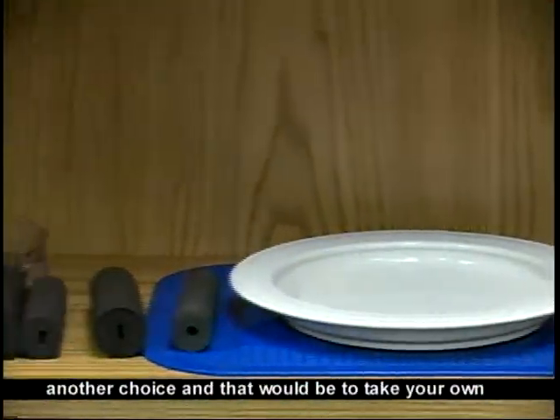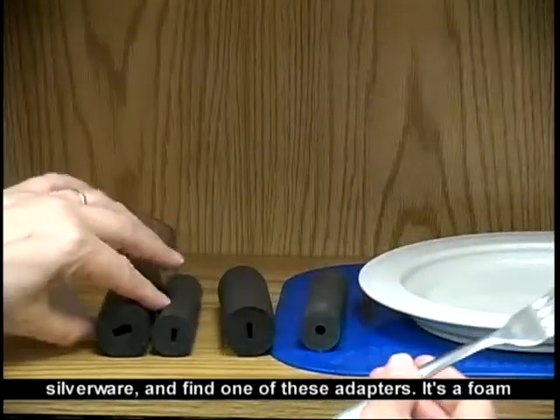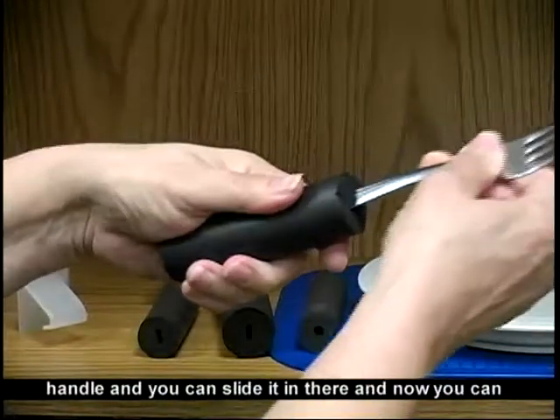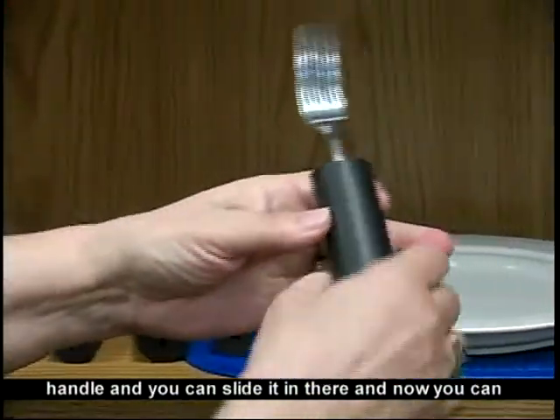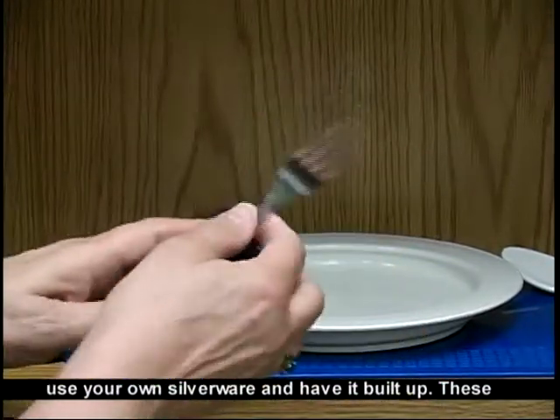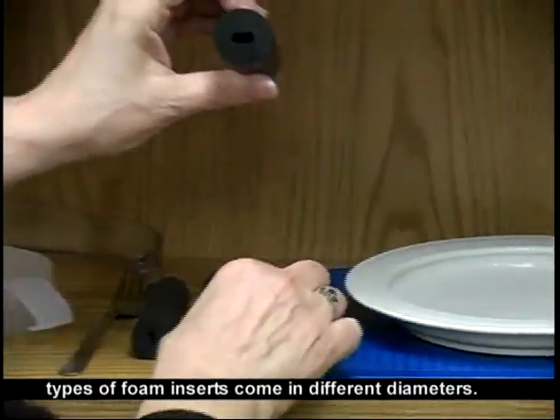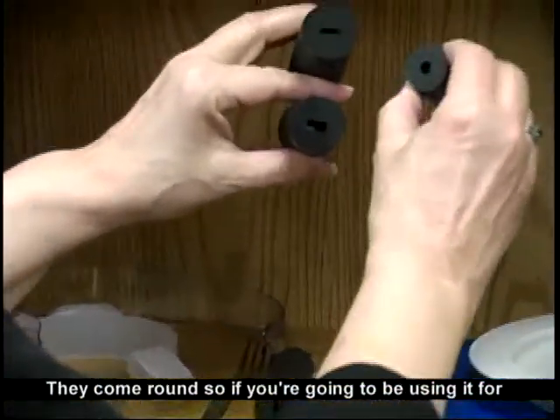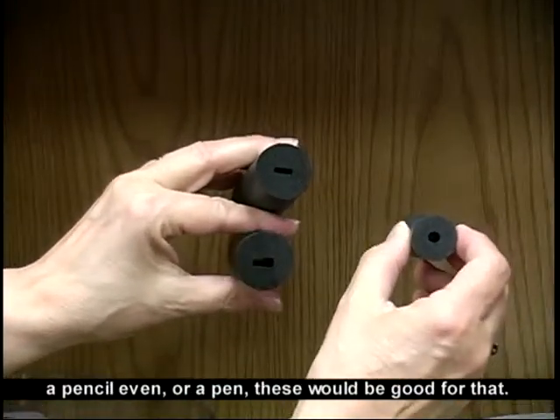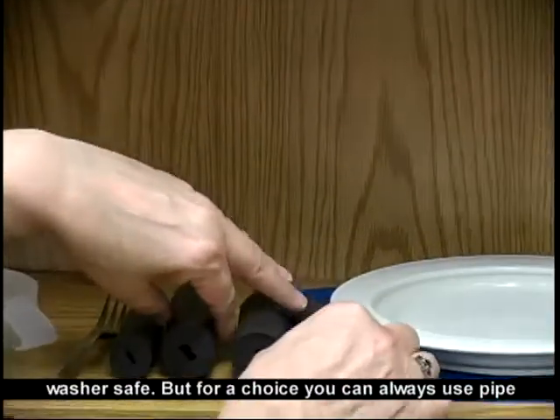And then there's another choice, and that would be to take your own silverware and find one of these adapters. It's a foam handle, and you can slide it in there, and now you can use your own silverware and have it built up. These types of foam inserts come in different diameters. They come round, so if you're going to be using it for a pencil even, or a pen, these would be good for that. These are industrial grade, heavy duty, dishwasher safe.